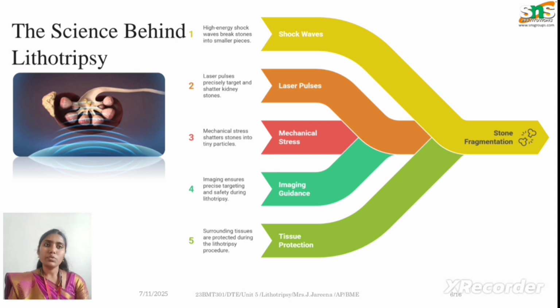For example, through urine or through some other ways, within 1 or 2 days, all the fragmented pieces, the smaller pieces, will get rid from the body. So this is how lithotripsy works.